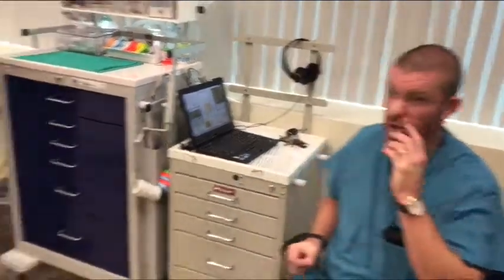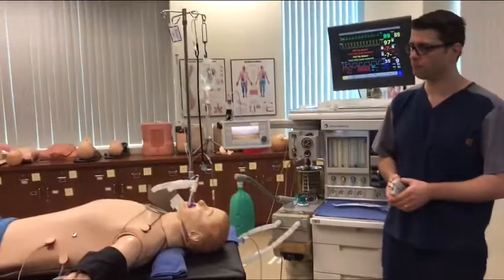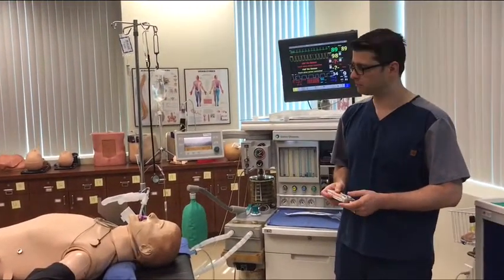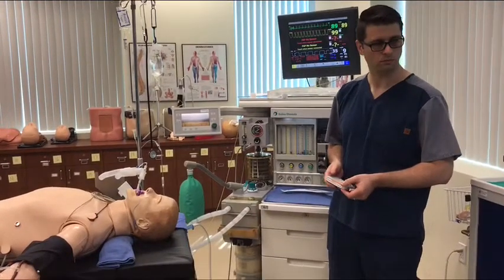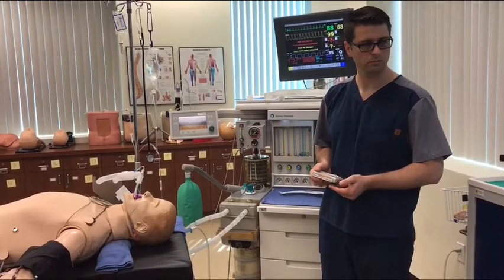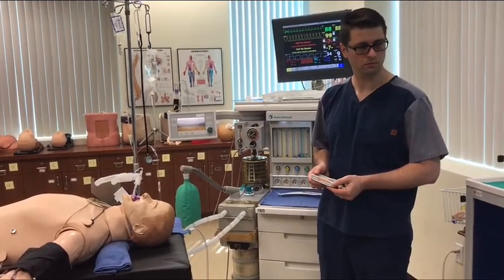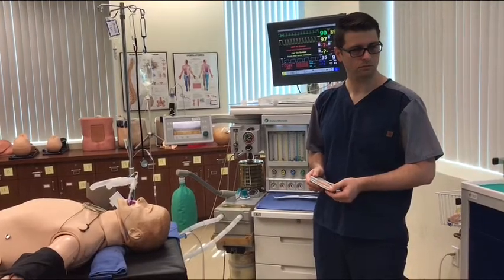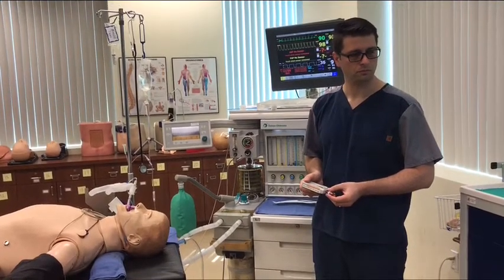Okay. So what else are we doing? Go over everything we did again. We're blowing off gas. We've put in the oral airway. We've suctioned the oral pharynx. We've got all of our supplies up there. We've given our antagonist for the muscle relaxant. We've given our PONV prophylaxis. What's the next thing we're going to do? What are we waiting for next?